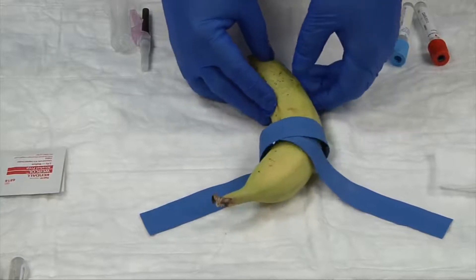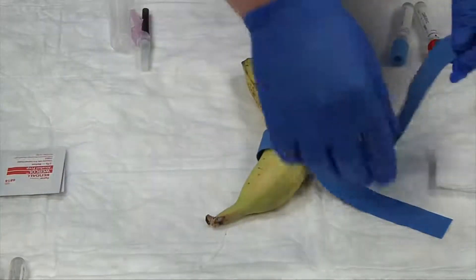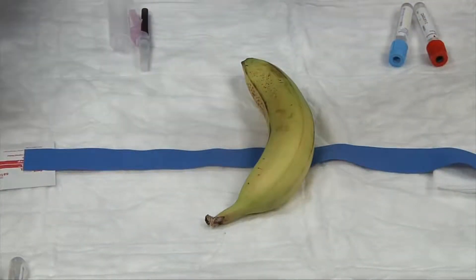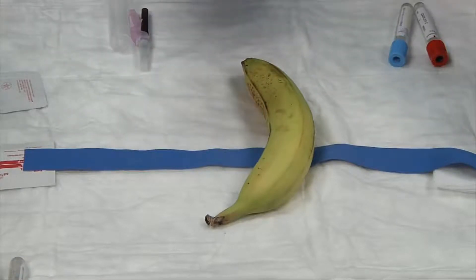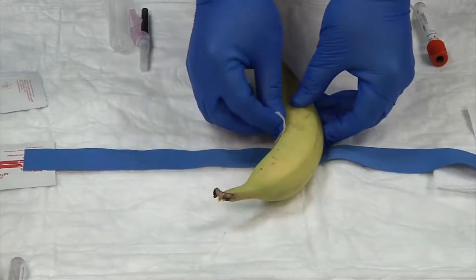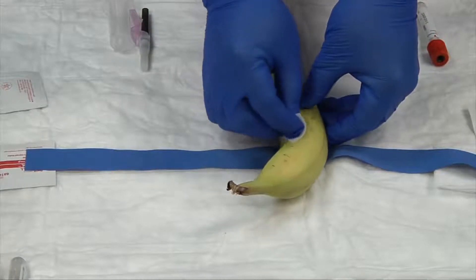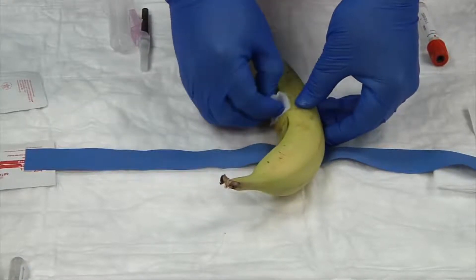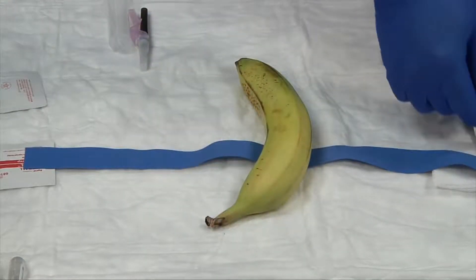I've found my landmark. As a new phlebotomist, until you pick up speed, you'll want to release your tourniquet for a minute as you cleanse your patient. Take your alcohol swab, start in the center where you'll do your puncture, and go in a circular method from inside out — never back in. We want to push the dirt away from the site.